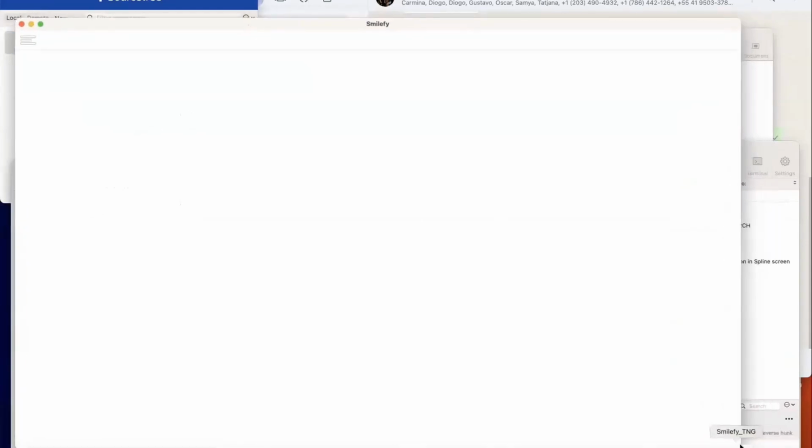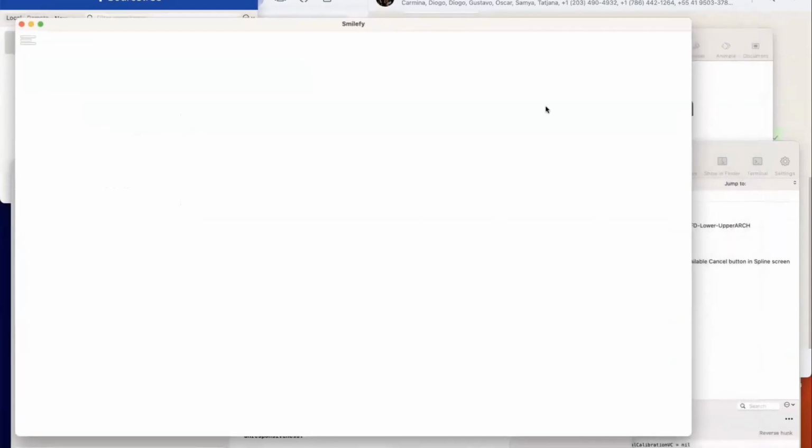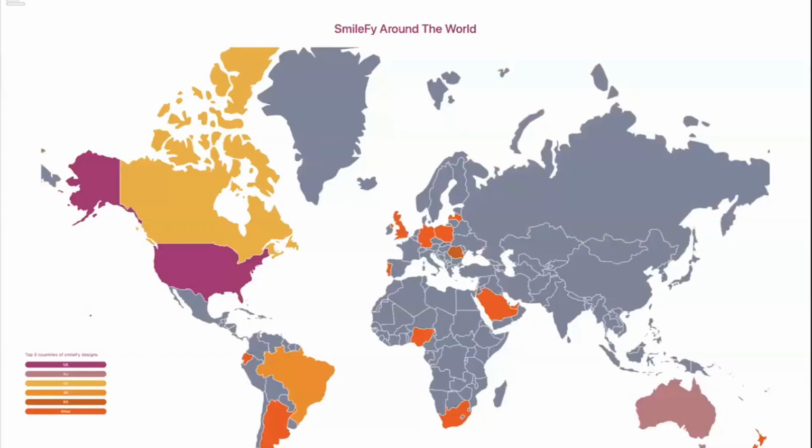3D Smile design. Now, just imagine if you send your Smile design to your lab. It takes maybe 1 week, maybe 2 weeks. Then back and forth. I don't like the canines, change the size, angulation, and all this stuff. I want you to have control over the case and the mockup.